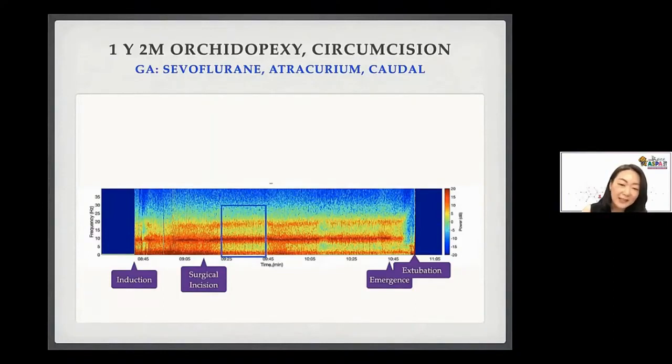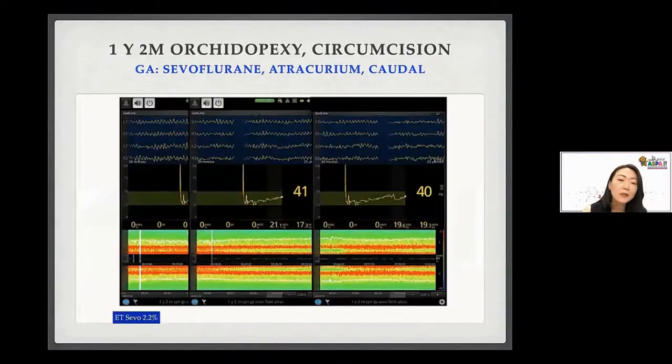So at this part, you can see the child's a little bit lighter. You have the slow delta oscillations at the bottom here becoming a little less prominent. Likewise, at this point, the child is also a little bit lighter. You can see the slow delta oscillations there at the bottom. And then you have alpha and almost beta at the top there. So this is what you see on the screen clinically, and I'll just talk you through the case.